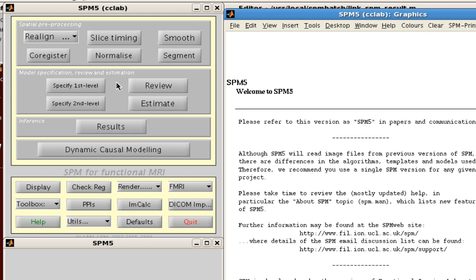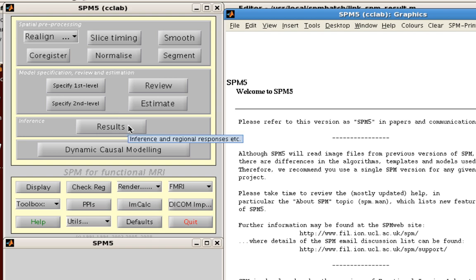And then you have specifying your actual model. So remember for each individual subject that's considered a first level analysis. And then at a second level analysis, what you usually do is you average across the beta weights for individual subjects to create a second level result.